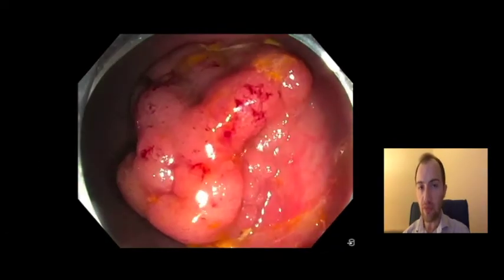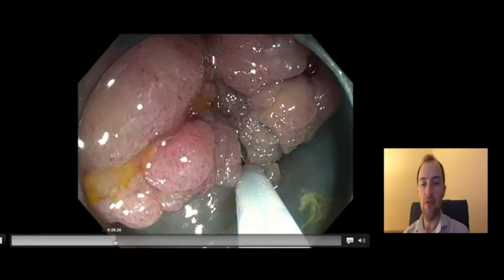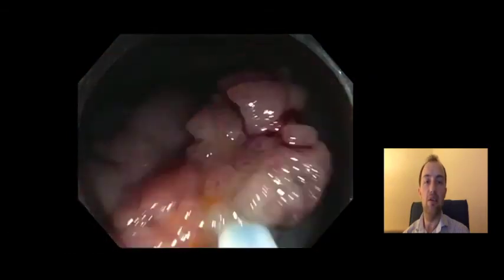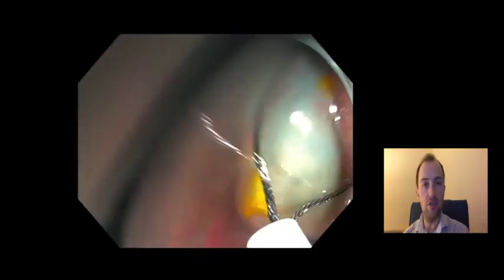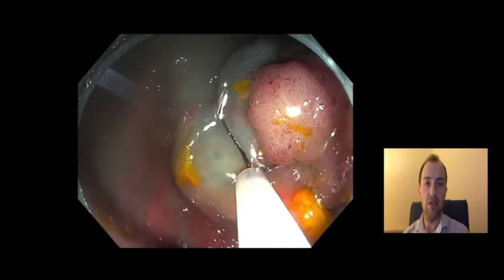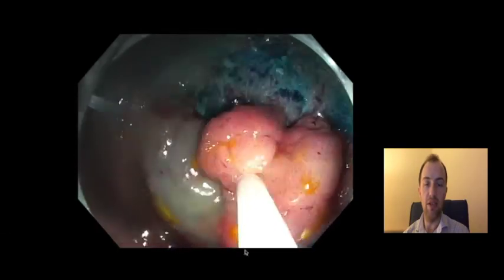So this lesion completely encircles the AO, and you can see that as we progress through the video, sequential inject and resect EMR is how we proceed, and we work from the cut edge of the defect with a thin wire snare, here a Boston Captivator snare, 10 millimeters in maximum dimension.